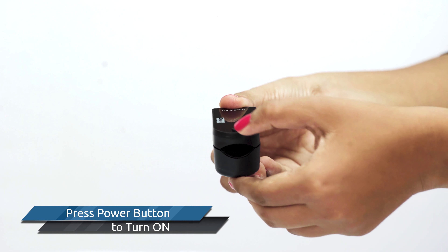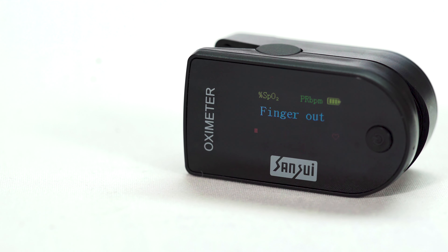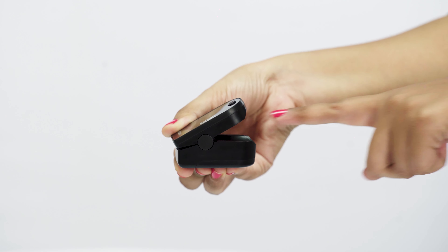Read the relevant data directly from the display after 15 to 20 seconds of reading to get the most stable and accurate reading. The Sansui Oximeter has an auto-sleep option and will enter a standby sleep state if no finger is inserted. Unexpected movement may cause incorrect readings.